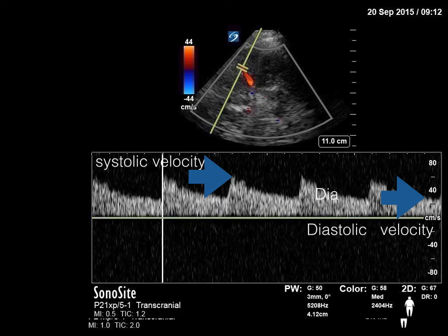Now, what will happen in stroke? In stroke, distal to the stroke area, there will be a decrease in systolic flow. And at that systolic, this is a very complex thing. We'll go one by one. I have all the categories, starting from brain death to stroke to hemorrhagic stroke to ischemic stroke. Every slide is there. When we start the paid version, we'll put all of them.